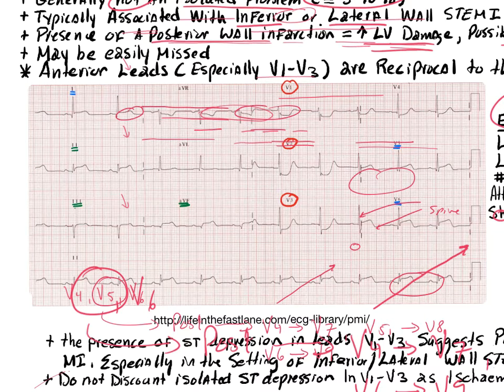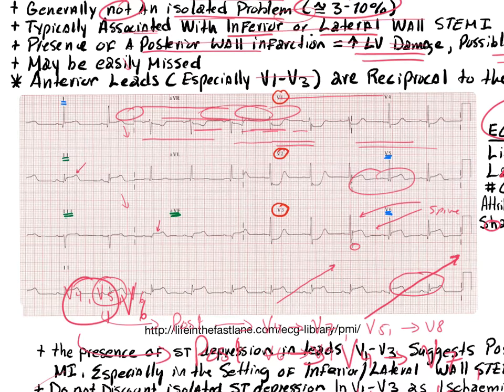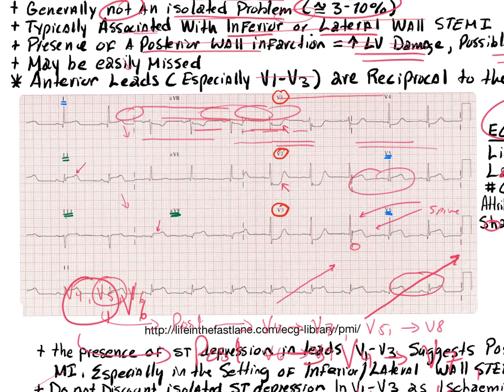Starting at leads 2, 3, and AVF — the inferior wall: there's elevation in leads 2 and 3, and elevation in AVF as well. Leads 2 and AVF are contiguous, so we're already looking at an inferior STEMI. Moving to V1 and V2, we see ST depression. V3 and V4 also show some depression — that could be a reciprocal change, since the anterior septal leads are roughly reciprocal to the inferior wall.